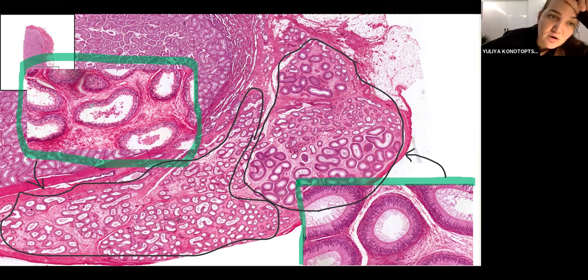So basal bodies are under the cilia. So the cells here, some of them are ciliated, some of them are not ciliated. You do not see it, right? For example, here, no cilia, but then you see that there are cilia. Where is this situation present? In the vas efferent. That means that this area where I magnified into, this is a vas efferent.